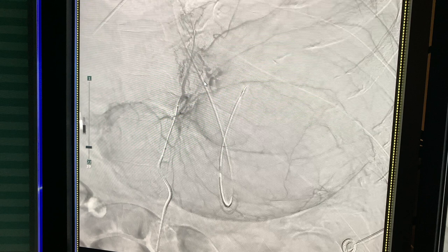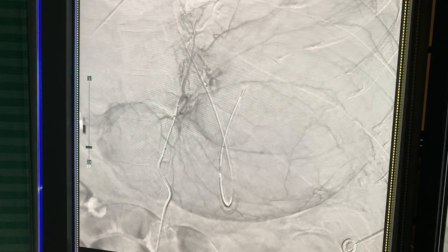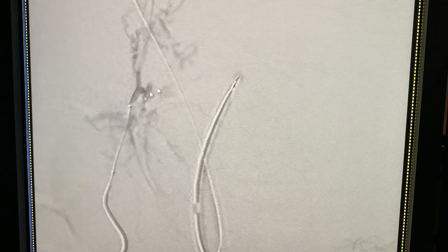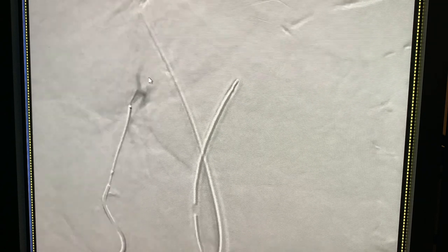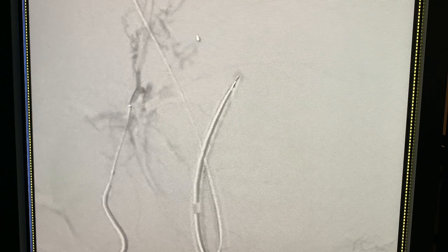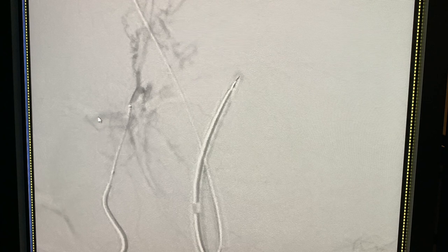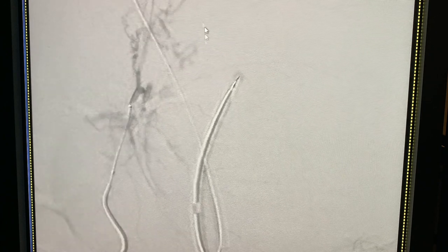This is a zoomed-in closer view of the area of concern. You can again see the extravasation here. It's subtle because the patient is very large so the images are not very clear, but there is the area of extravasation.